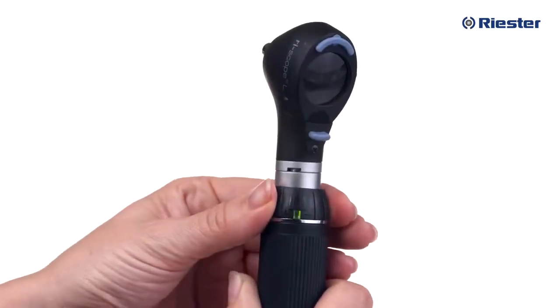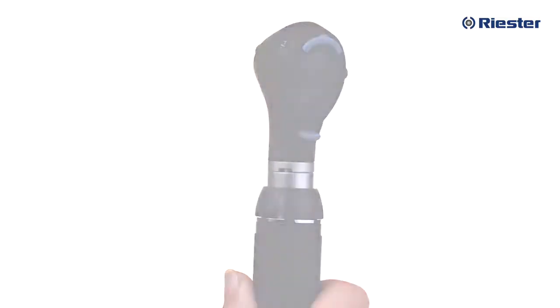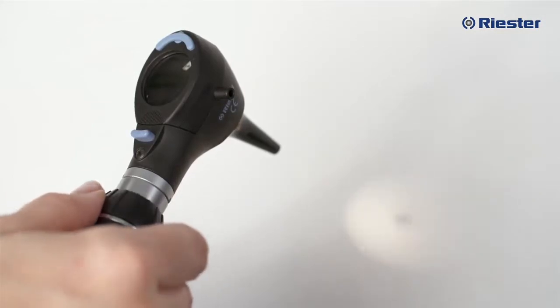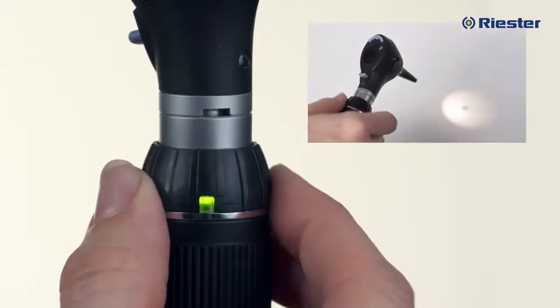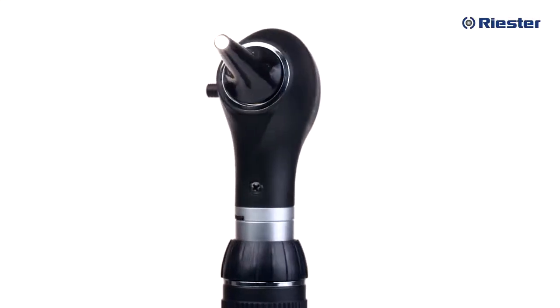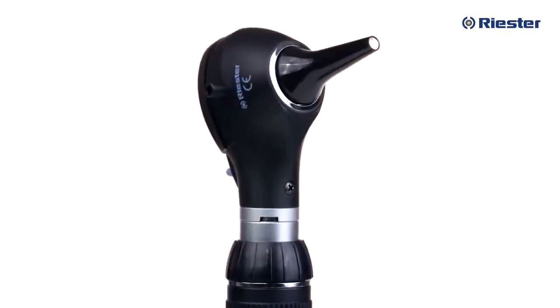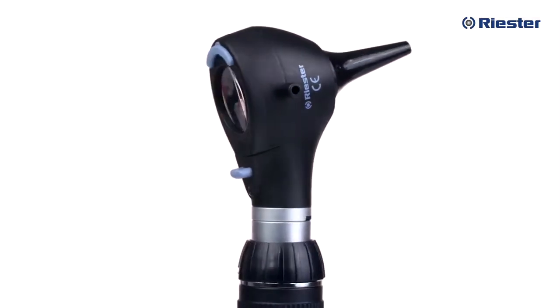You will need to hold the collar in the off position for approximately two seconds to completely power down the instrument. This unique feature also allows you to dim the illumination during use. Rather than twisting and holding the collar toward the minus position, turn the collar with short, simple twists to stair-step the light intensity down to a lesser intensity. If you accidentally forget to turn off your instrument, don't worry — all Riester RiScope handles will automatically turn off after 180 seconds, helping to preserve the life of both the battery and the bulb.